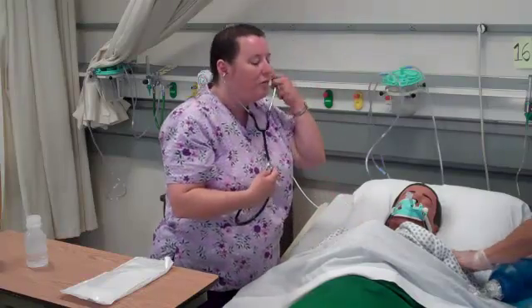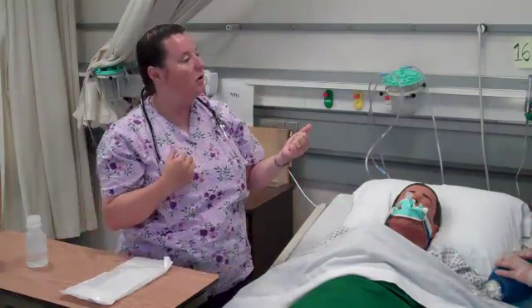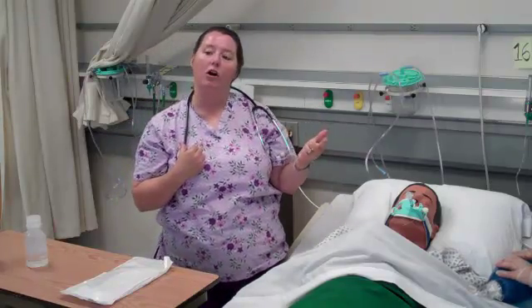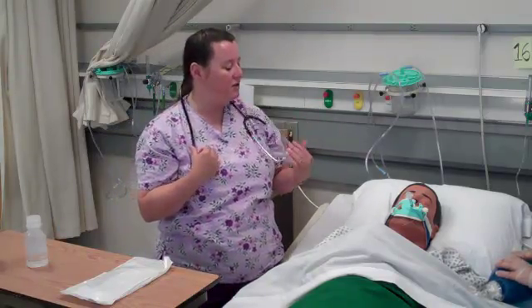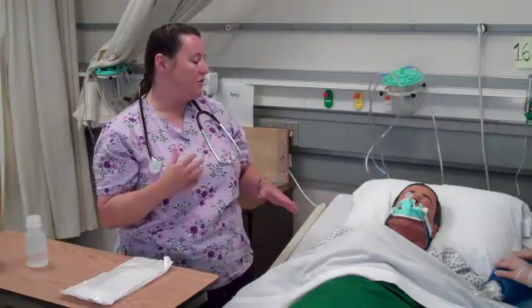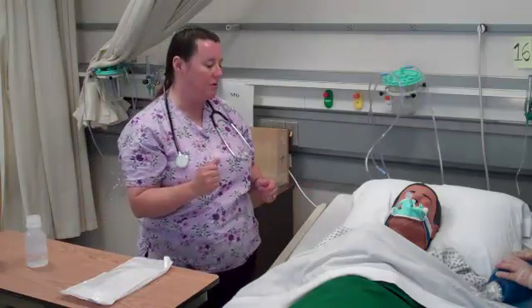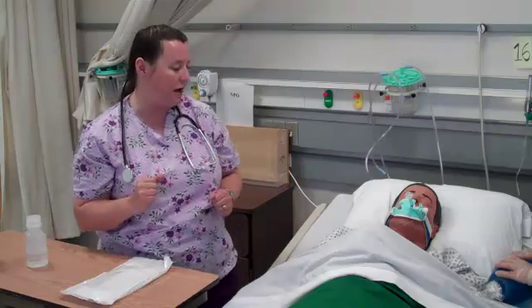I'm looking to see if what I hear compares with what I might see on the monitor — things like a low O2 sat, increased heart rate, increased respiratory rate. I might see the patient is a little bit more anxious, more restless, showing some agitation. That condition would probably warrant suctioning, and my doctor's order authorizes me to do that.